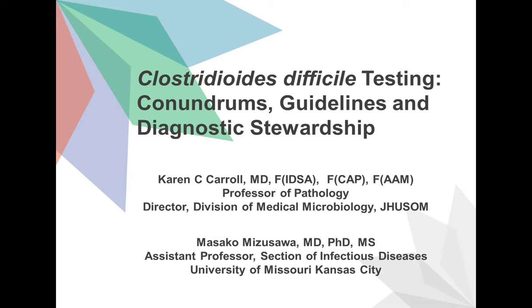Yes. Are you aware of any NHSN or CMS discussions of the promotion of this approach and its effect on CDI rates in an institution? Yeah, unfortunately, I don't know of the discussions that are occurring, but the person who framed this question is absolutely correct. And I've had enormous pressure to do this as well, although there isn't good consensus among our clinical staff. I do know that our infection control folks have tried to make the case, at least with NHSN, that Hopkins should not be penalized for using a sensitive single test method when others are sort of gaming the system by confirming their NAT with an insensitive EIA test.